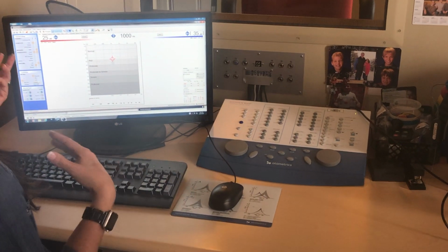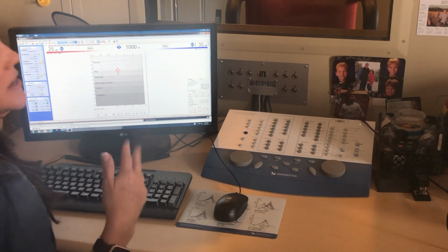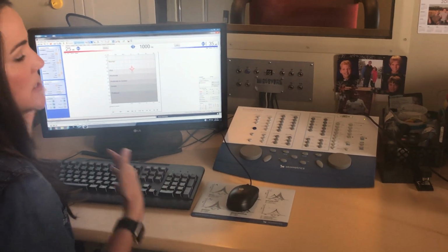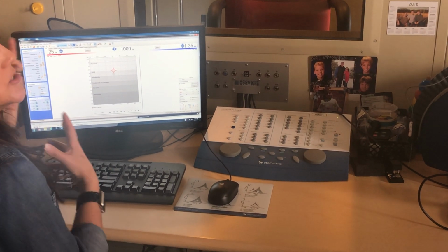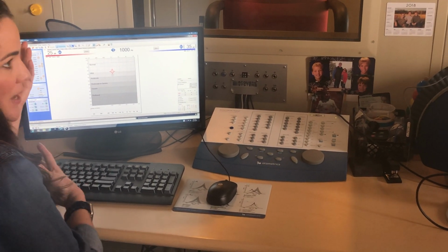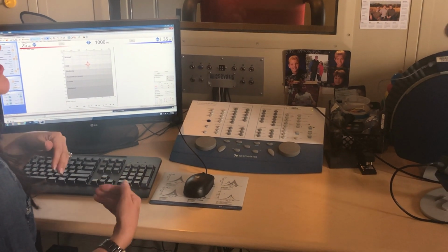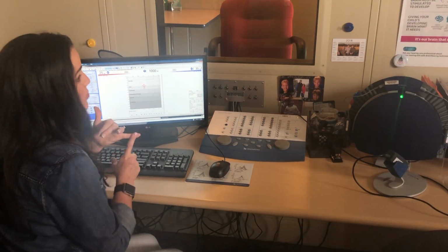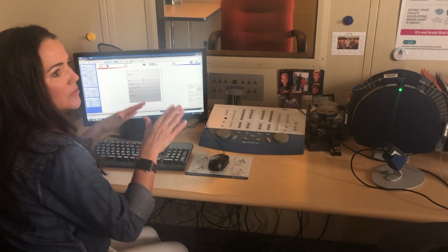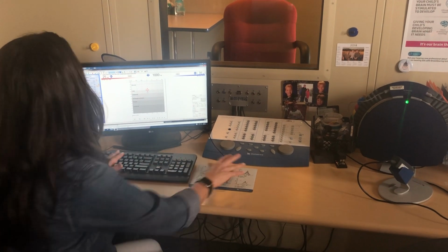If they have tinnitus or tinnitus, both words are used, and it's okay. If you have a patient that is really struggling with tinnitus, then you can change it to a pulse tone, and that just helps them sort of grasp the sound that we're presenting over the tinnitus that they're hearing. Tinnitus, if they have it, will usually get worse during testing because they're quiet. It's a quiet room, and they're concentrating on really soft sounds. Okay? So that's how you do it out here.